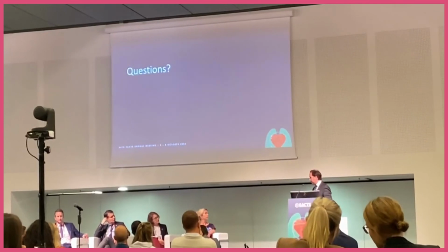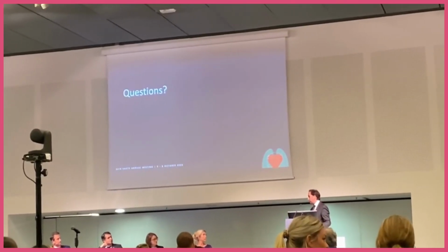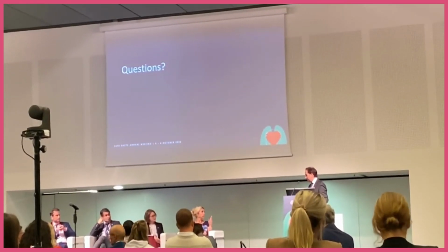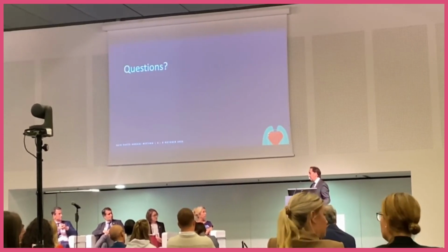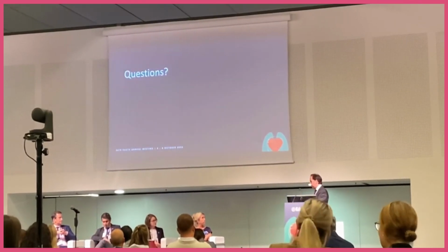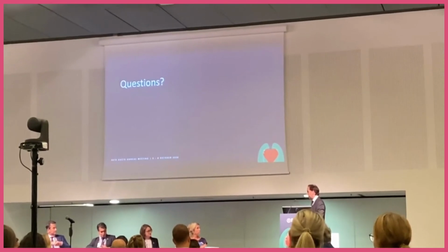And you can also do side to side, I guess. In essence, this is a side to side. We have an alternative clip for a clear end to side device, but theoretically you can make jumps with this, as long as you start proximally and work your way to this part. And put the left to the right, so when you make a Y anastomosis, is that also possible with the device, to connect the two mammaries? Theoretically, yes. We already made end-to-end anastomosis also with another clip, so there are multiple options. So maybe in the future we'll have an armamentarium of different clips to be utilized for any individual patient to create different graft constructions, striving towards full arterial revascularization by mini access.